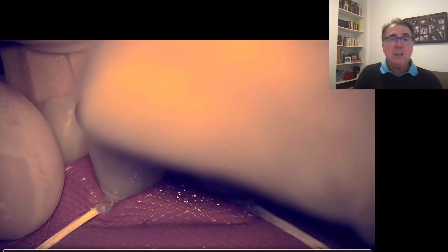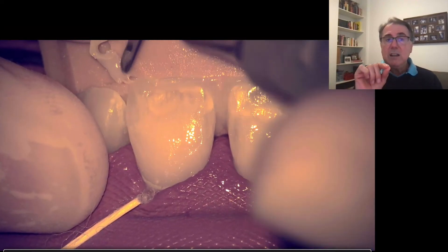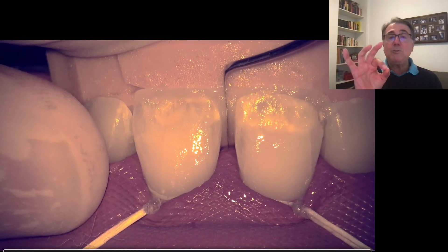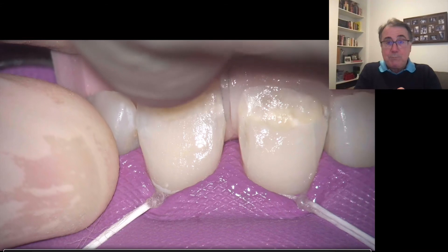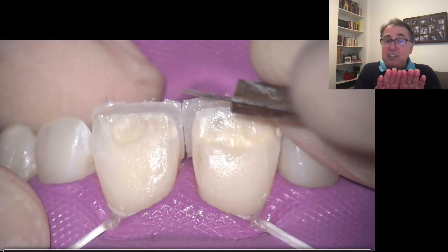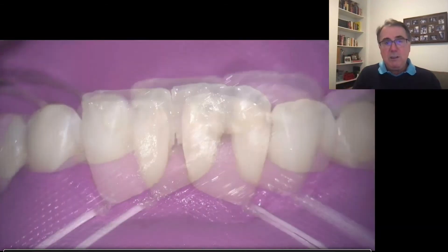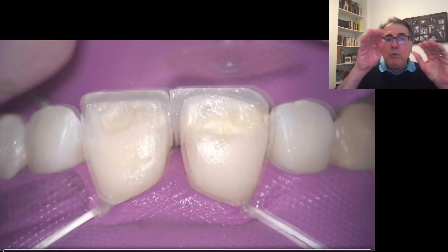It's important to have this layer of composite that will become the palatal surface of my restoration — I'll call it a palatal shell. So within the space of the diastema, I will have a palatal shell on the right central and on the left central. I'm removing all the excess, and it's important for me to leave that layer very thin — as thin as 0.5 millimeters thick. Now I'm cutting through that silicone shell, making the separation of those two teeth, using a very small saw to separate them. Then I use a Sof-Lex disc very gently just to smoothen out the incisal edge.